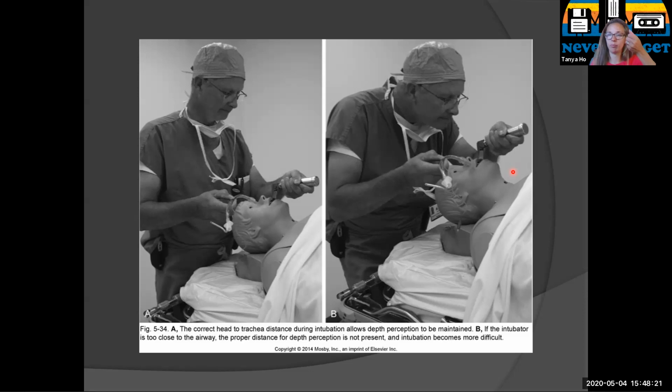You don't just keep doing this to try to visualize. You've got to reposition the patient, or figure out your technique or what you're doing, so that you're able to visualize a little bit better, okay? So you've got to try to do something different and fix something. And if you're still not getting it in, it shouldn't be 4 or 5 different intubation attempts, because now they will become a difficult airway. Somebody's been jabbing in their throat all this time, and they're going to be swelling up.